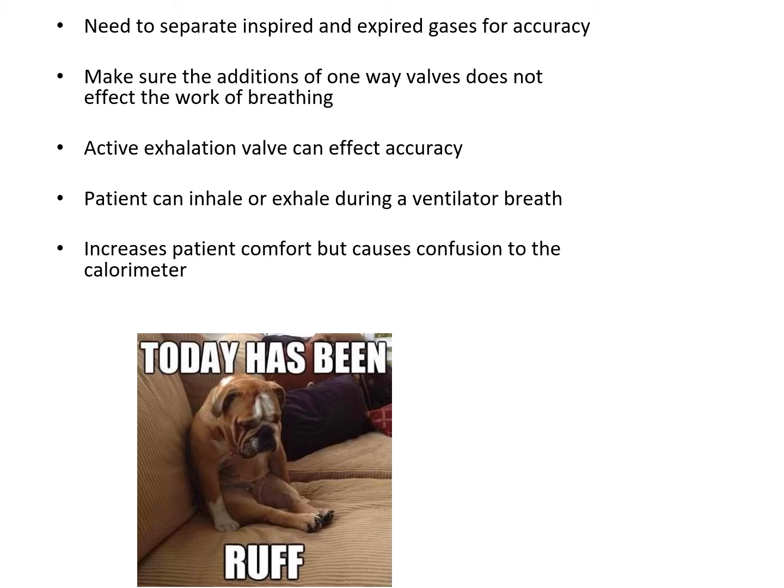Active exhalation valve can actually affect accuracy because it's staying open. Making sure a patient can inhale or exhale during a ventilator breath can also increase patient comfort, but causes confusion to the calorimeter.